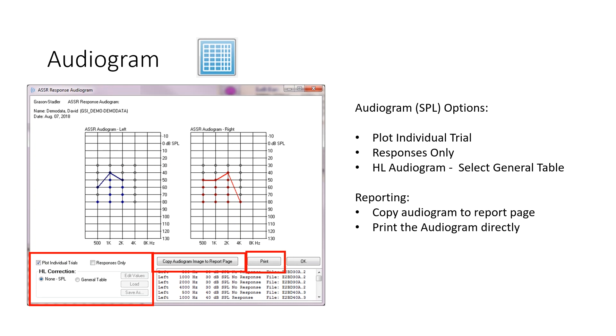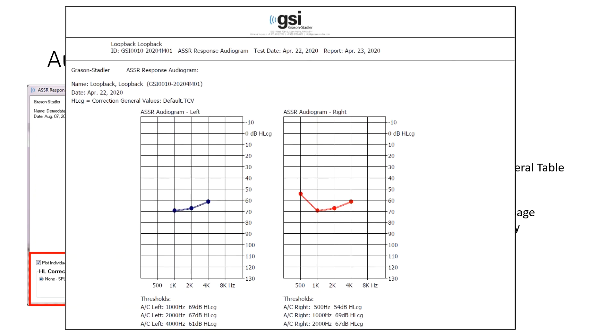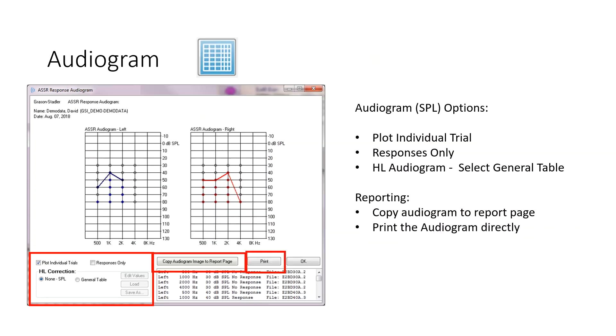And when you do that, you're going to get an audiogram that looks like this. So that would be the easiest way to get your ASSR results printed. If you use copy audiogram image to report page, you can then use that if you've already done ABR and import that image into your ABR report. So you would have both ABR and ASSR in one report.